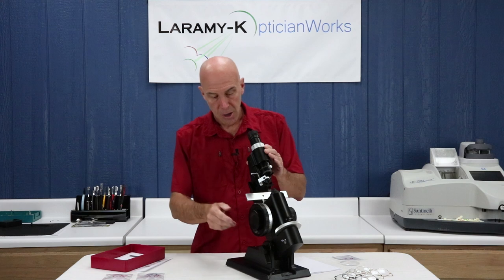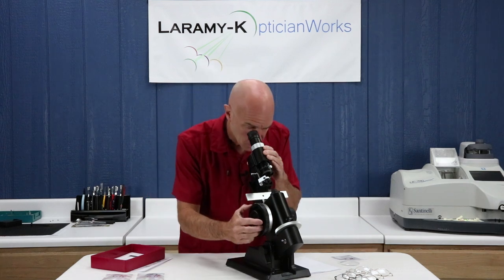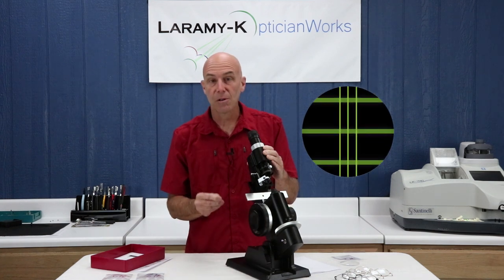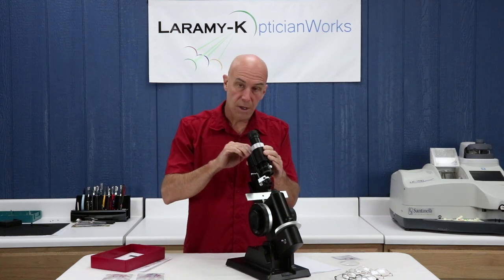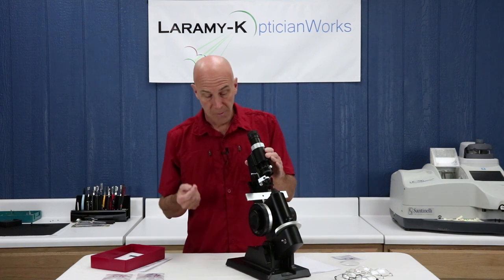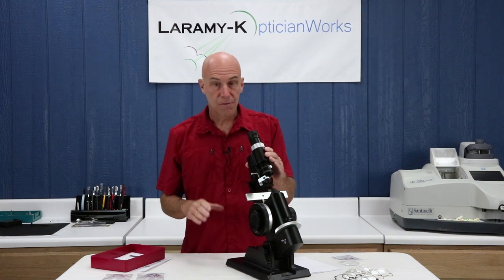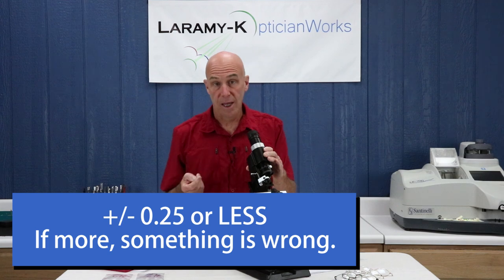I can turn the lens meter on. I take my power drum and rotate it into the high plus — around plus seven. I'm going to look inside and slowly turn my power drum away from me until my sphere lines and cylinder lines are crisp and sharp. Again, no rocking — only turning it away from me. Once I'm sharp inside and I look down at my power drum index, I have a perfect zero. If I have a perfect zero, the instrument is now adjusted for my eyesight. If it's a quarter plus or a quarter minus, try it again — perhaps without your glasses. You may simply always be a quarter strong or weak; just account for that and don't reject work that is actually perfectly okay.